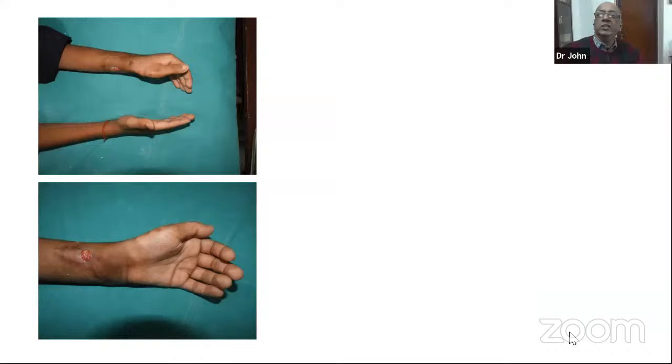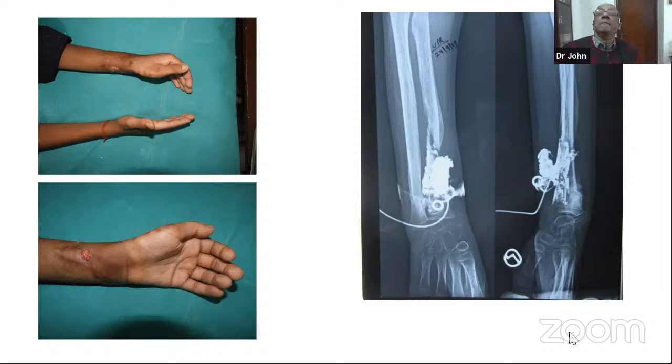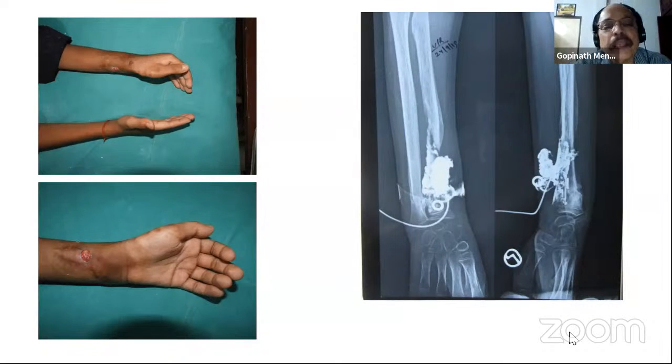PN, since you wanted to say something, just a quick comment so that we can move on. What I wanted to say was that there appears to be some amount of involucrum formation if you see the serial radiographs. So I would wait for a couple of months, maybe another 6 weeks before chipping in for removal of this. Yeah. You'd still wait? No, John, I think probably an external fixator spanning the wrist joint and then remove the sequestrum and wait for that, because there is good evidence that new bone formation is going to occur.